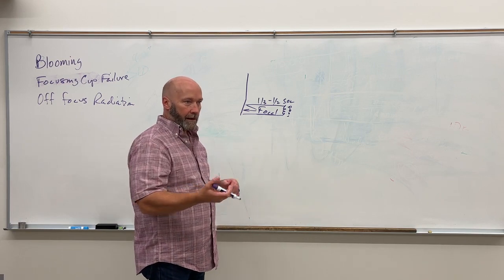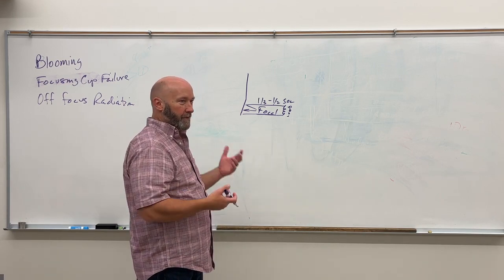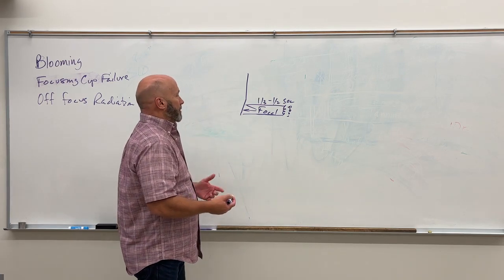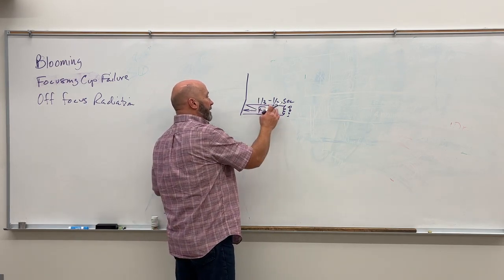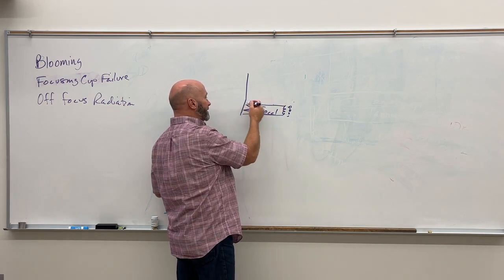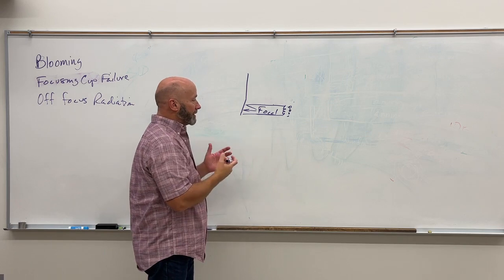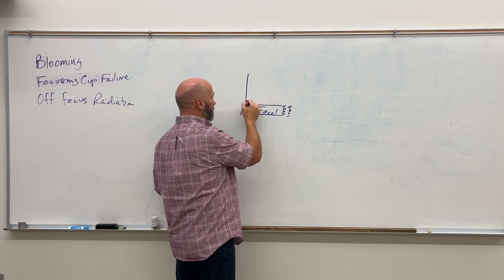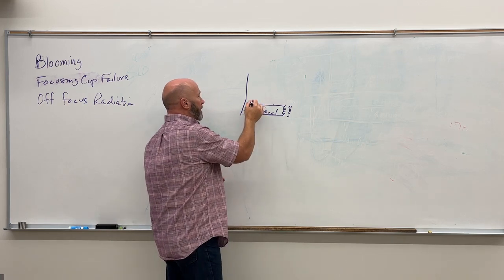Anytime you throw matter hard enough, there's the likelihood that it could bounce. So say an electron travels across the tube and hits hard enough that it doesn't just slow down. It hits something solid enough that it reverses its course and bounces backwards.